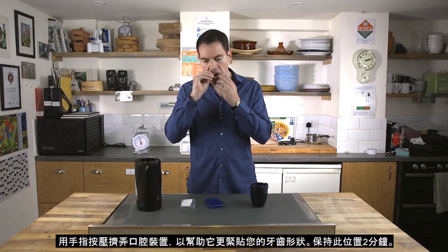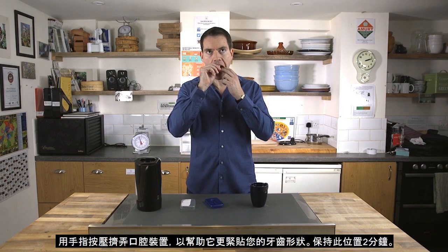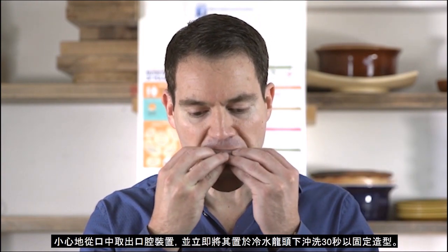Use your fingers to press the Oral Device against your teeth as this will ensure a better fit. Carefully remove the Oral Device from your mouth and immediately place it under cold running water for 30 seconds to set the moulding.